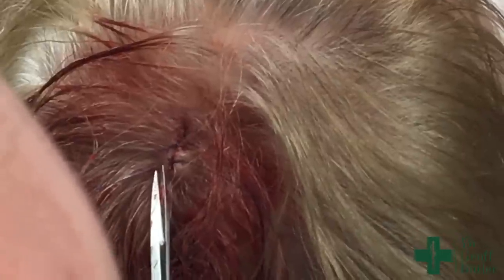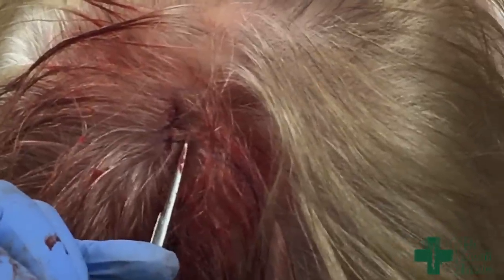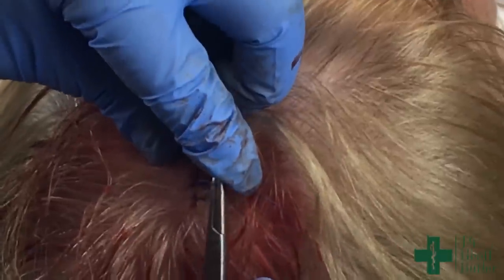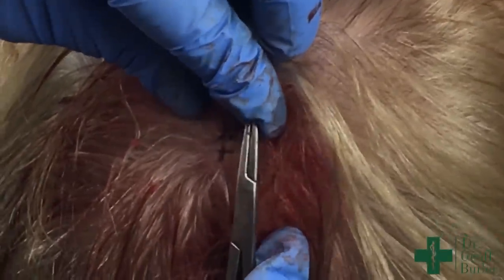The scalp can bleed quite a bit as we saw — this actually wasn't too bad — but you'll oftentimes want to put a pressure dressing on these. Even when we stop the bleeding, it can ooze a lot. So oftentimes put a little bit of a turban on them as they head out of the office, just to make sure that's clear.